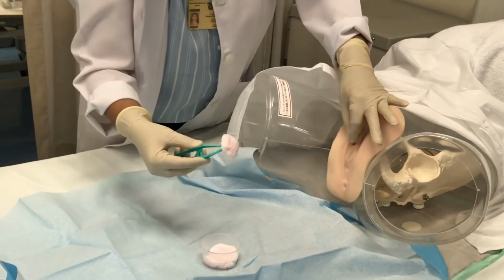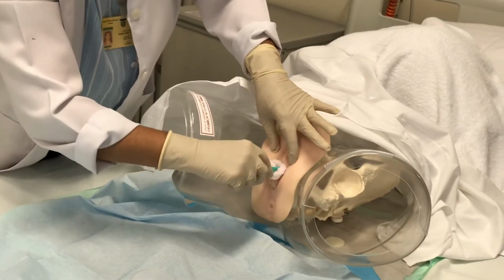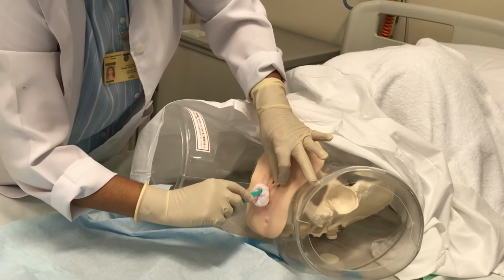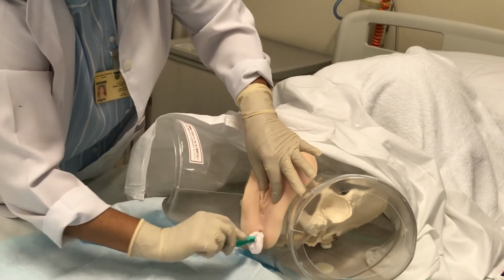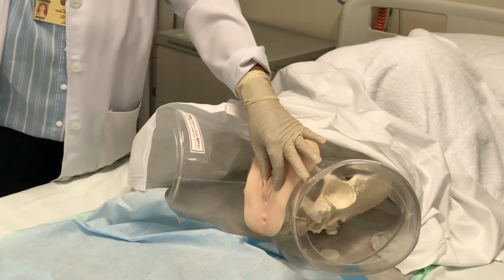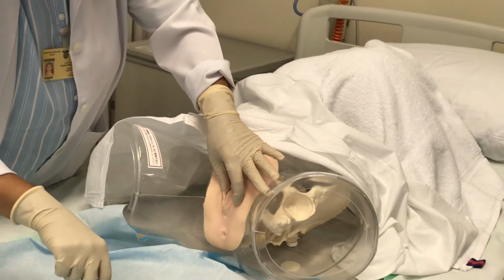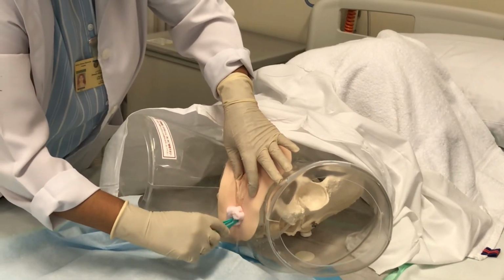Now I can spread the labia minora as such. Here it is not so easy, but I have to spread and clean it. Once only, up to down, once only. From this side also, clean it down.